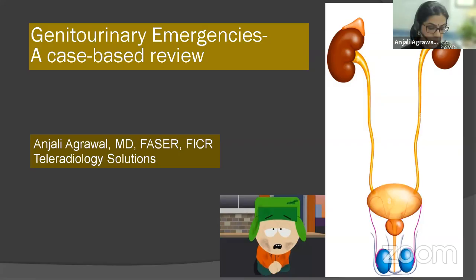So I have a few questions here. Inguinal hernia on ultrasound, please tell anatomy. You know, I think I should show you the images, which I don't have, unfortunately. Maybe this can be taken up later, but the CT anatomy, I'm sure you're aware of. You have to look at the location going medial, inguinoscrotal, going medial to the pubic tubercle on CT, and of course the inferior epigastric artery. Those are the landmarks, but ultrasound, I'm sorry, I don't have the images.